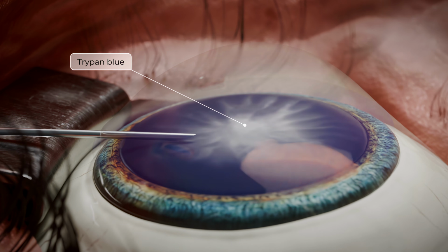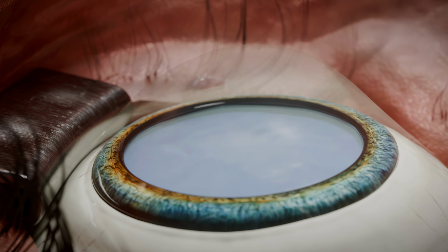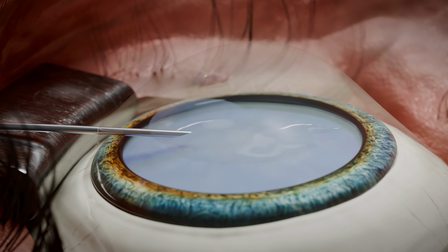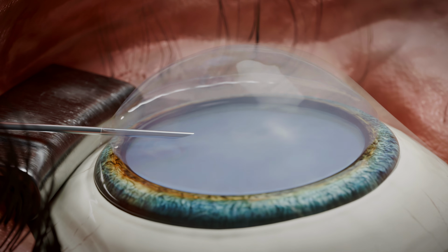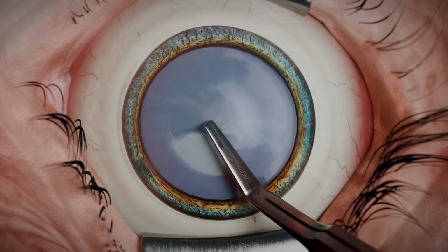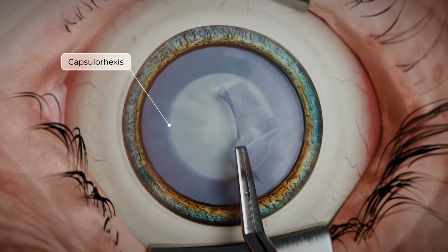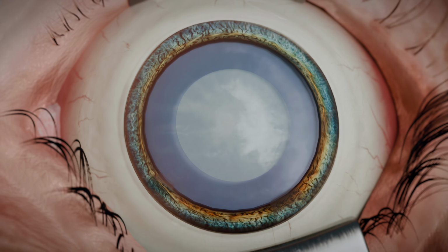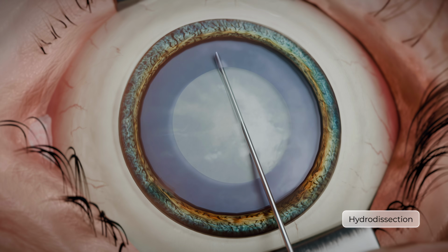Trypan blue is applied for improved visualization of the lens capsule, and a viscoelastic agent is injected to maintain the anterior chamber depth and protect the cornea. The next stage is the creation of a continuous curvilinear capsulorhexis with a diameter of 5.5 to 6 mm using forceps. Hydrodissection and hydrodelineation of the lens nucleus are then performed to improve its mobility.